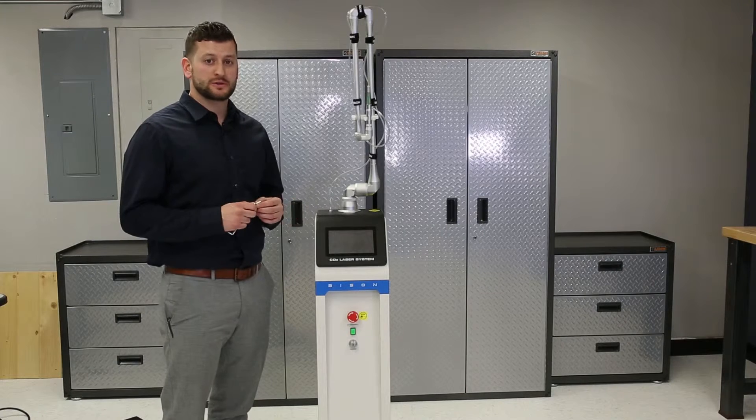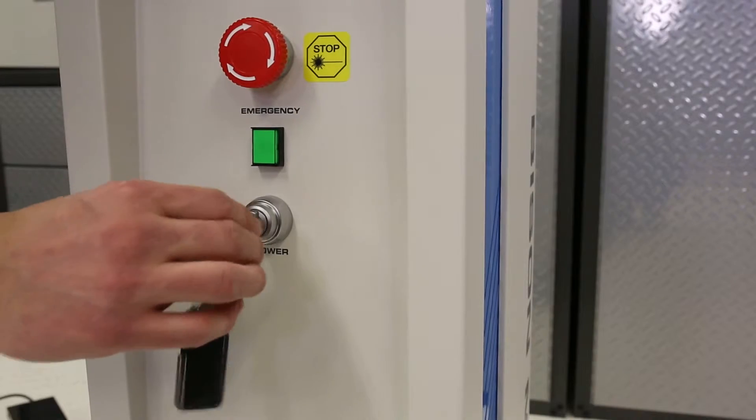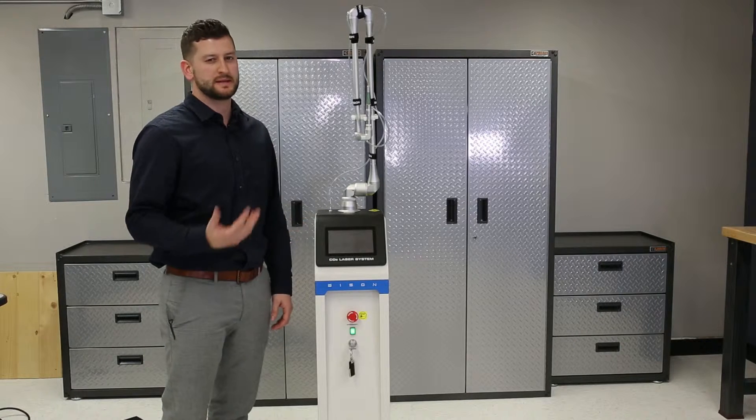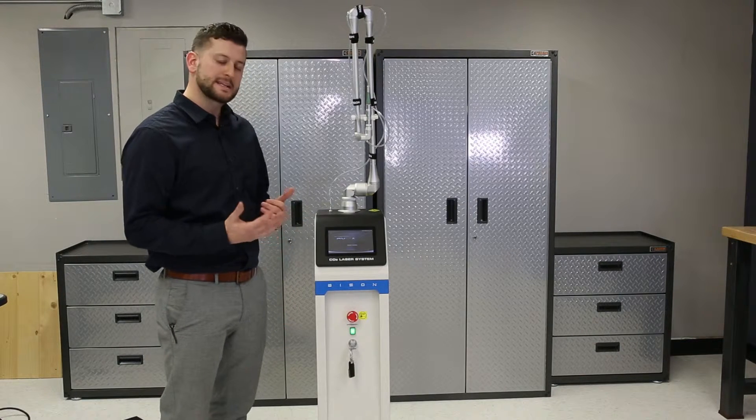Now you're ready to turn the laser on. Insert the key and you're going to wait for it to warm up. This may take 30 seconds.